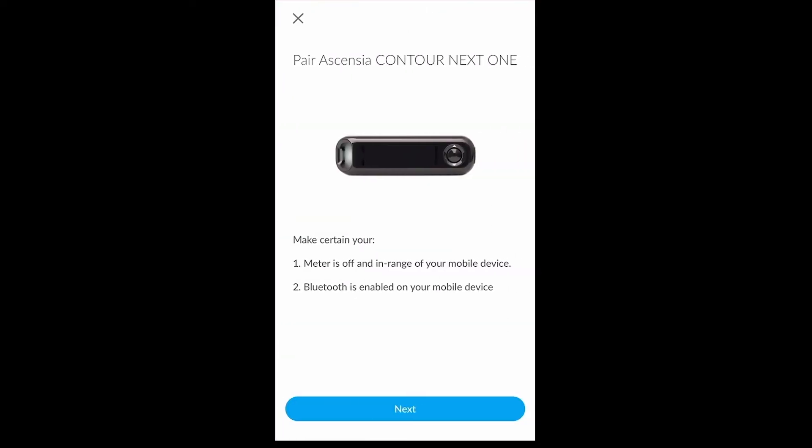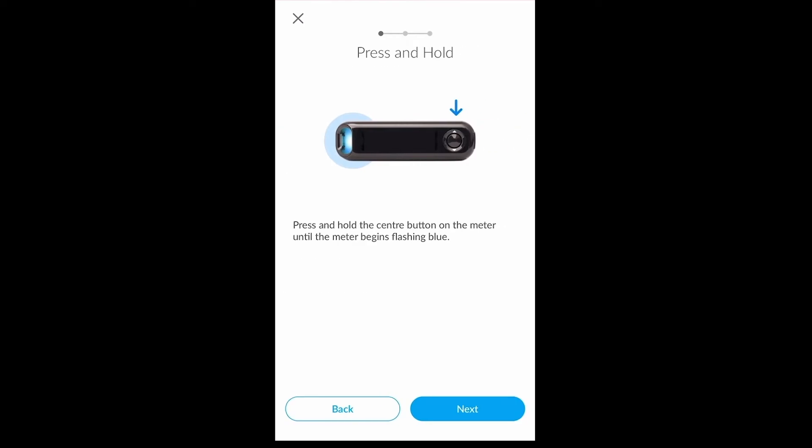Next you will see on-screen instructions that are tailored to the specific device that you would like to upload. Please note that these instructions will vary from device to device depending on the steps that are required in order to upload. Once you have followed the on-screen instructions, please click next.